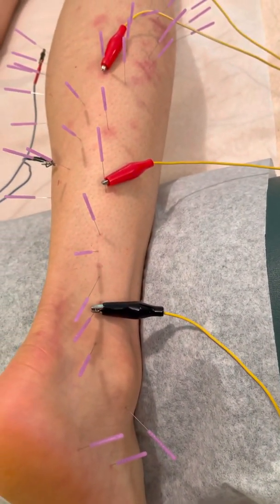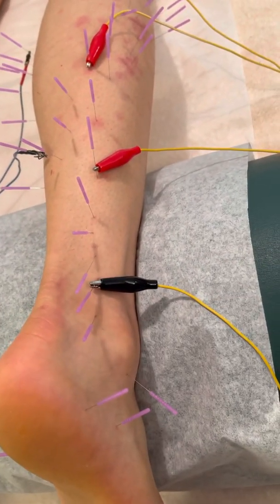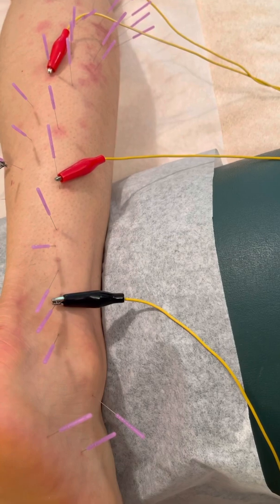And now we're going to make them stronger. Let's start with the one that I did first, down by the ankle. And so do you want that one stronger? Yes. Okay, so let's turn that one up a bit, and you say when.